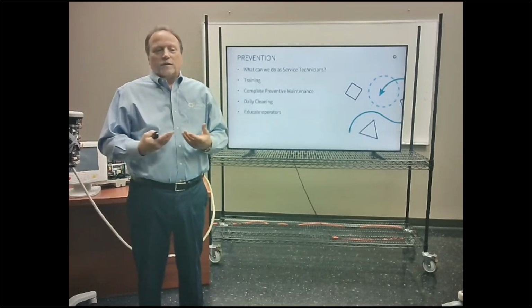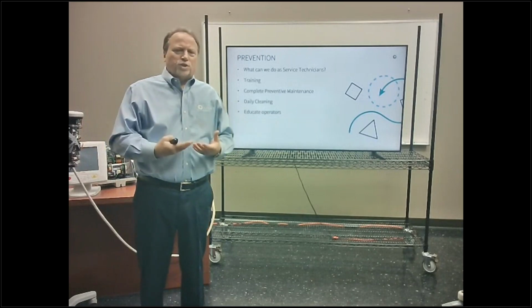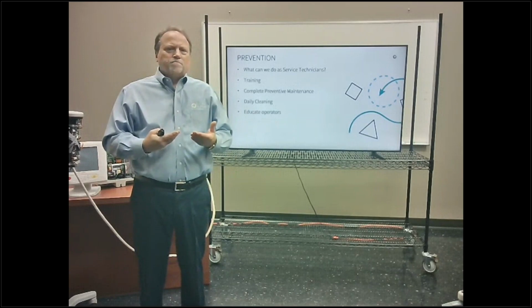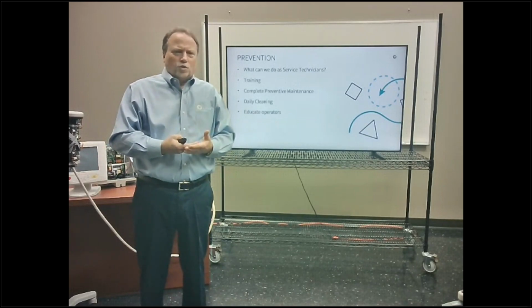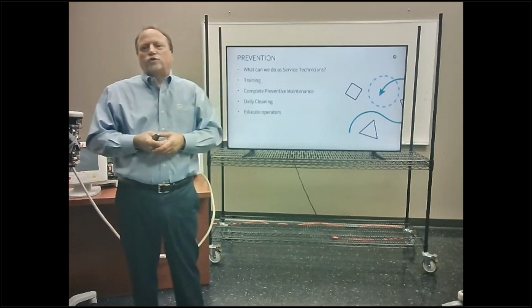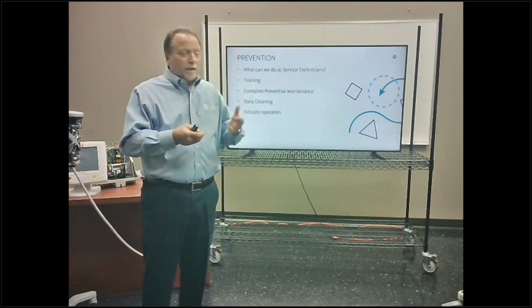And what's included? Well, you need gaskets. Contrast is a hard material when it dries. So if you have a foam gasket and contrast gets in it, guess what? That gasket is no good. It's not doing its job, and now you have contrast going onto the circuit boards. Change the gaskets out. Well, it doesn't look bad.